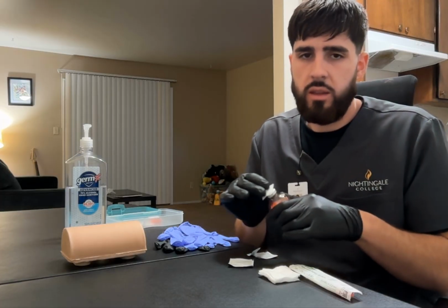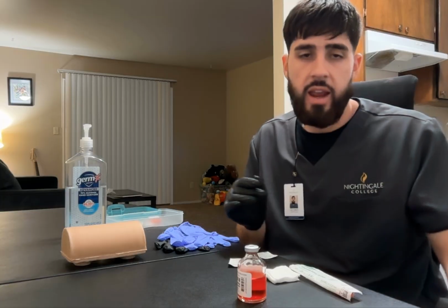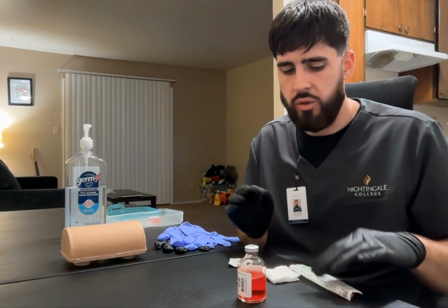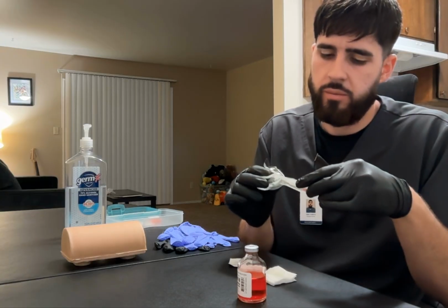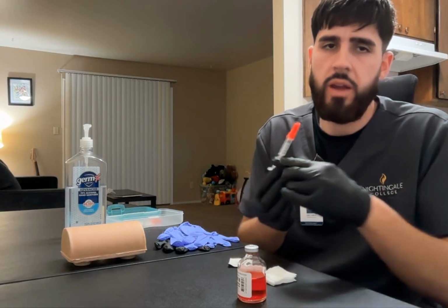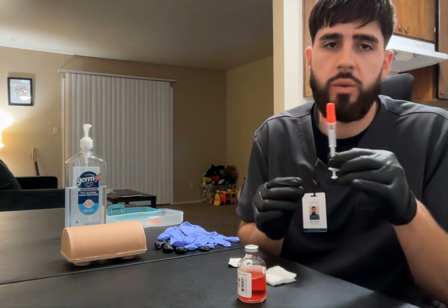I'm going to clean the top of my vial of tuberculin. Let that air dry. Throw my garbage away. Now for my syringe, I'm going to remove it from the packaging. Throw that away.